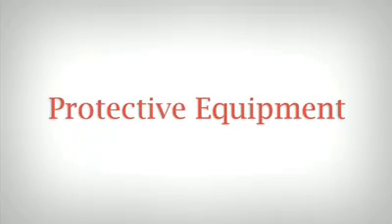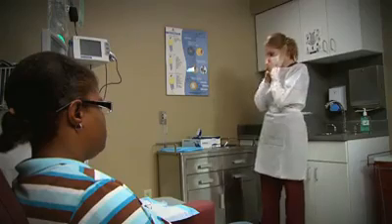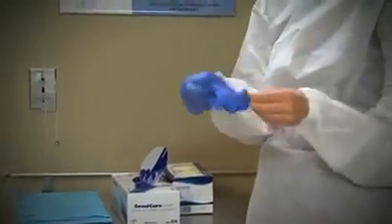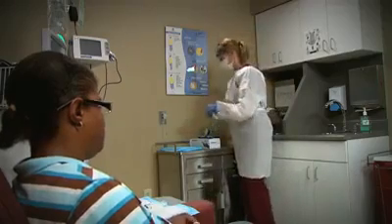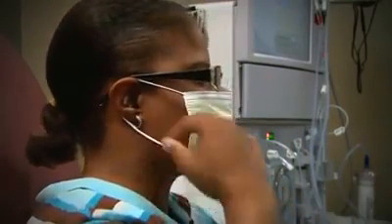Because the initiation of dialysis poses a risk for blood contamination, you must wear personal protective gear, including gloves, eye protection, and a mask and gown. A mask or face shield may reduce the risk of contamination of the catheter or site from sneeze or cough droplets containing infectious material. To further reduce the risk of catheter contamination, you may also want to ask patients to wear masks.